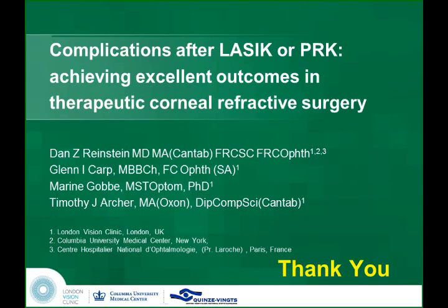So I check patients at 1 month, and that's when I decide if there's a bit of haze, to take them downstairs, do a 3 millimeter hole in the epithelium, and soak the sponge in. Fluorescein without harming the epithelium goes into the anterior chamber. You make a little 3 millimeter hole in the epithelium and put the sponge on for 2 minutes. Trust me, that mitomycin's on the retina. So there's no confusion about that, and it works. So we use it if there is haze, not to prevent haze.